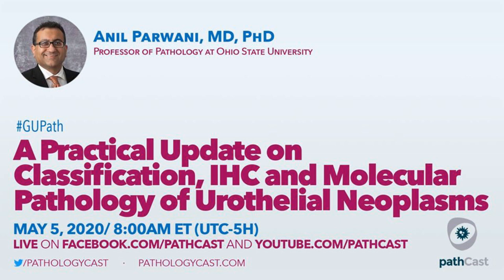You have to be careful about the subtype of the urothelial cancer you're dealing with, because a proportion of urothelial cancers can be CK20 negative to start with. So that will not help you in separating the two. But in many cases, it does. I will add P53 because it corroborates the CK20 staining, but it's not always helpful.